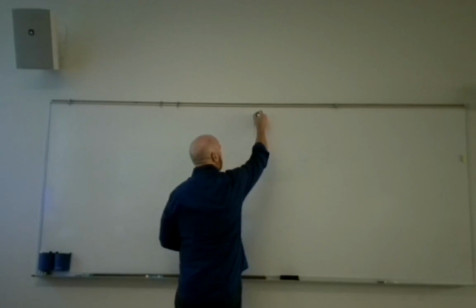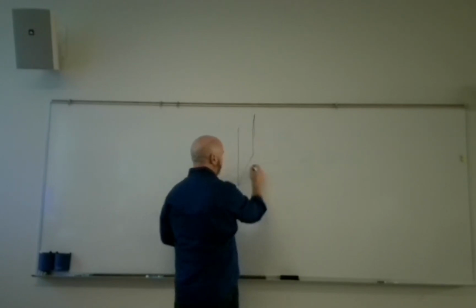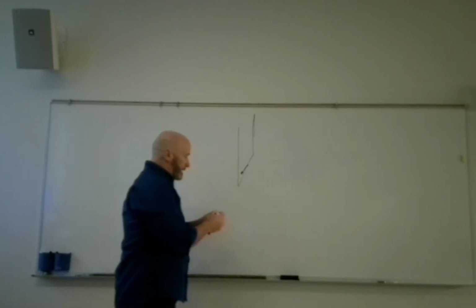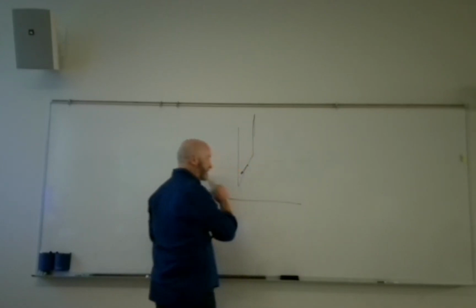Cathode end of the X-ray tube, right? That's because of the likelihood of absorbing some X-rays that you create in the anode itself. So you create X-rays here, they can't get through the anode. You're going to have less intensity on the anode end of the X-ray tube. But at the same time, you're going to have a difference in sharpness or recorded detail between cathode and anode end of the X-ray tube.